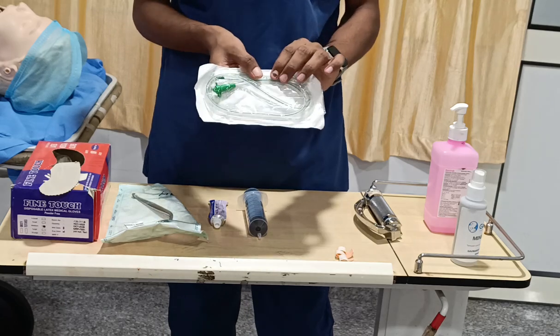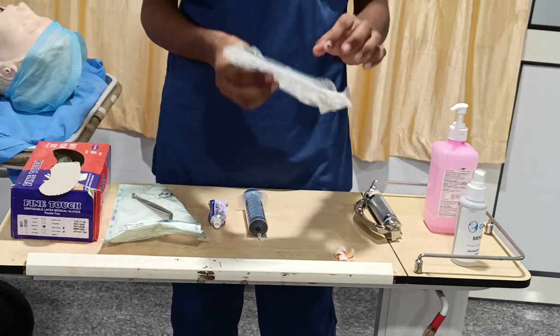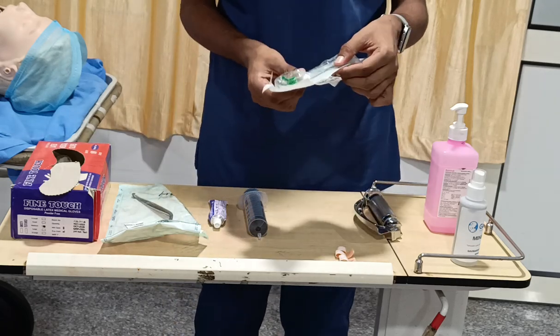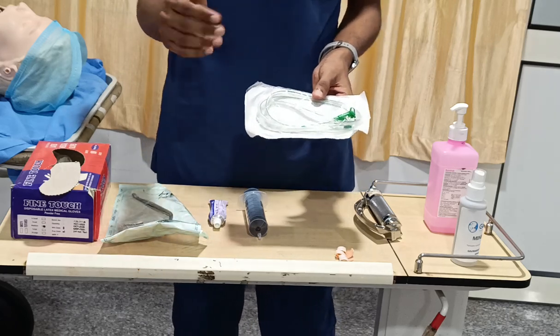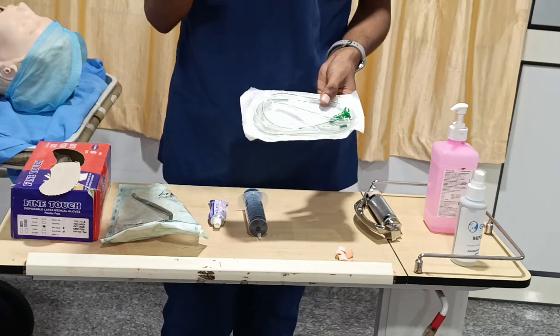Various sizes we have, starting from 6 to 26. Mainly, in our clinical setup, in adult cases we will use the green one. So how can you remember this? Commonly we will use orange, white, and then green. How can you easily remember the sizes? Take our national flag.